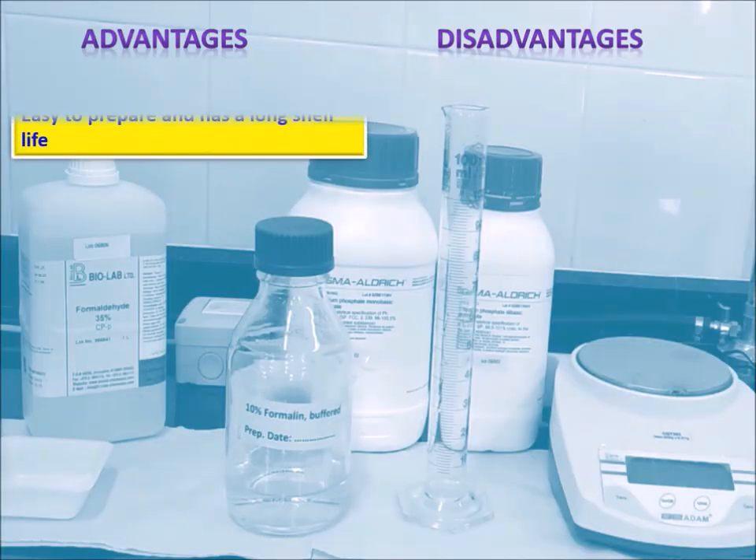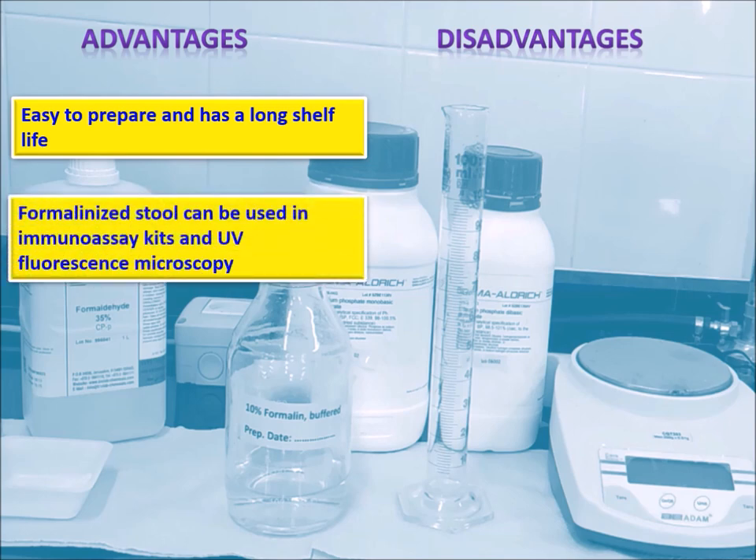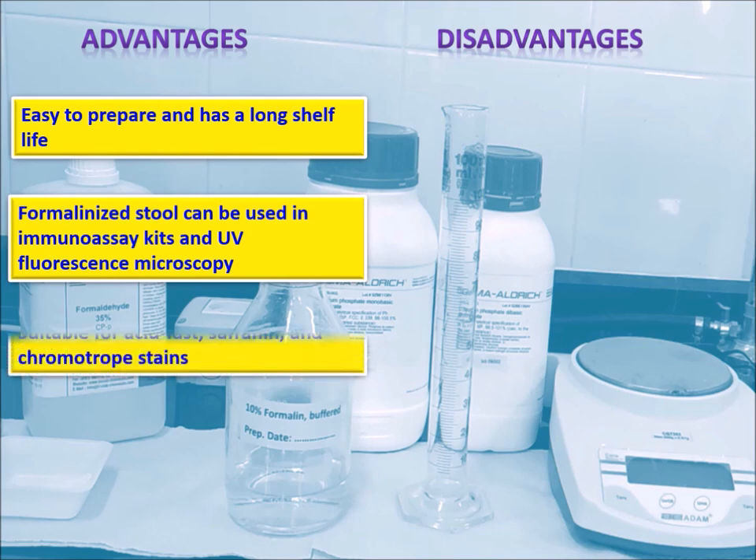In general, the preservative is easy to prepare and has a long shelf life. 10% formalized stool can be used in immunoassay kits and UV fluorescence microscopy. It is also suitable for acid fast, safranine, and chromotrope stains.